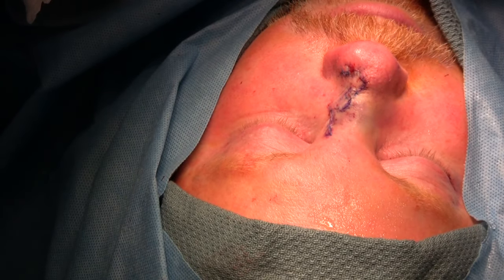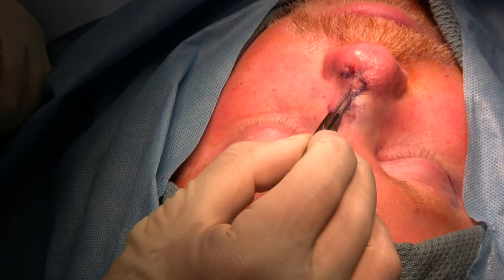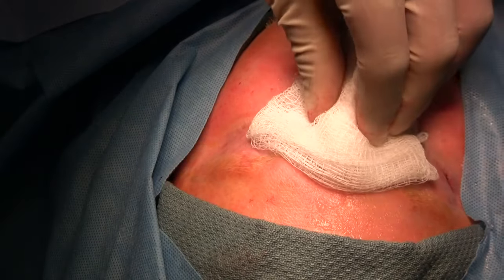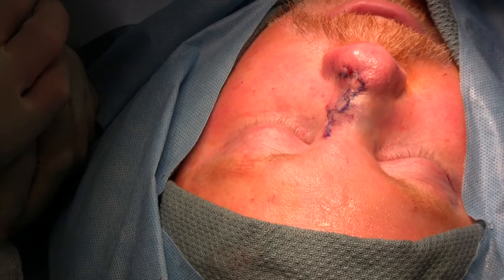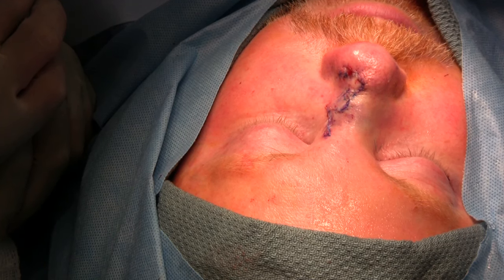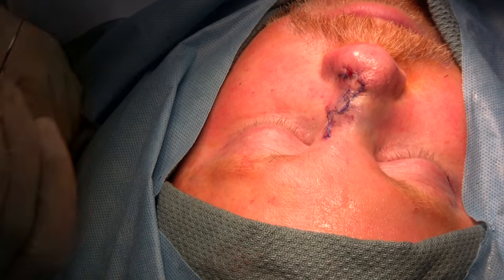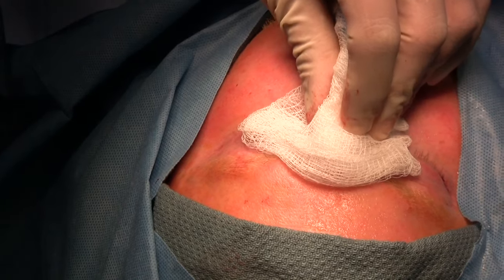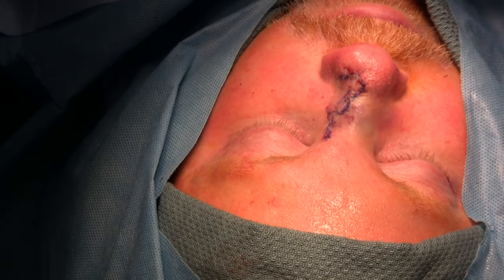At this time, the procedure is complete. You can see the final inset of the first lobe, the second lobe, and the closure of the last defect. We apply some bacitracin and we do not use any dressing on top. The patient is instructed to clean the wound with hydrogen peroxide three times a day starting tonight, apply bacitracin, and ice a lot for the first 48 hours. The sutures will be removed at about five days from surgery.